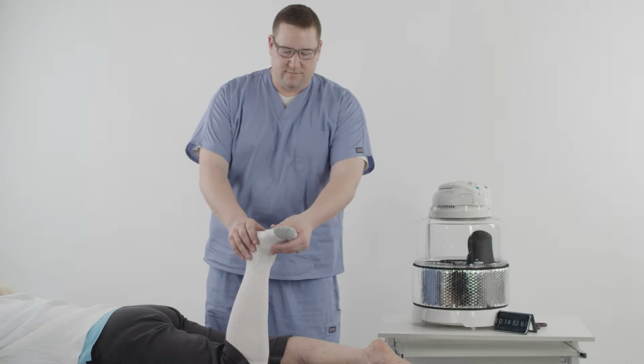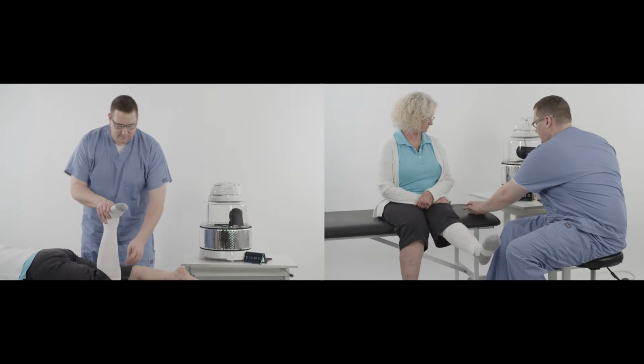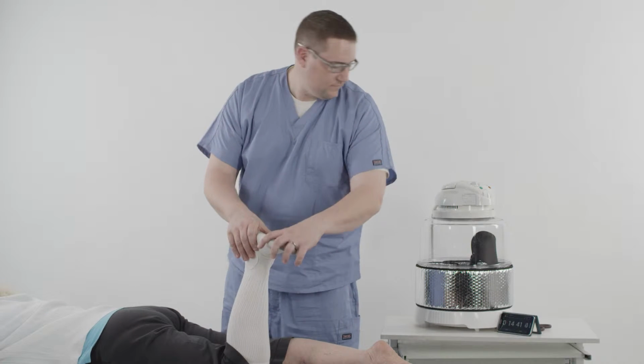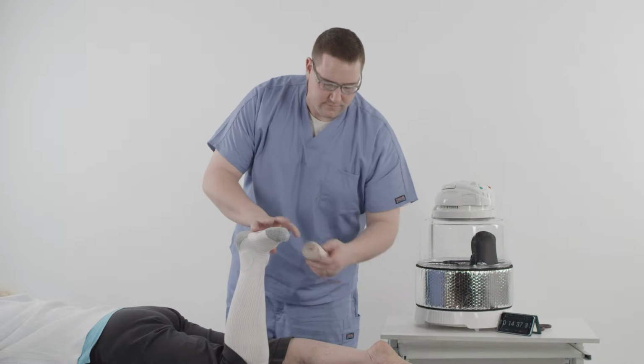There are 2 options for fitting the patient: prone or seated. The prone position is preferred for fitting the Exos free motion ankle. Once the brace has been in the Exos oven for 6 minutes, ask the patient to lie on their stomach.